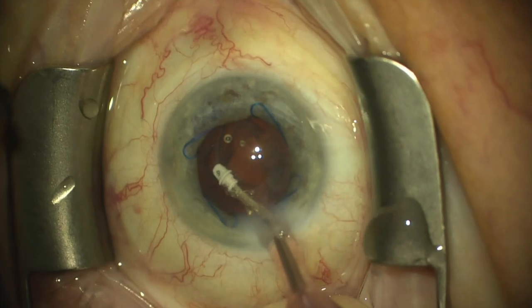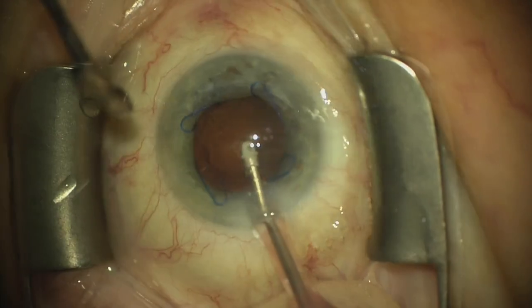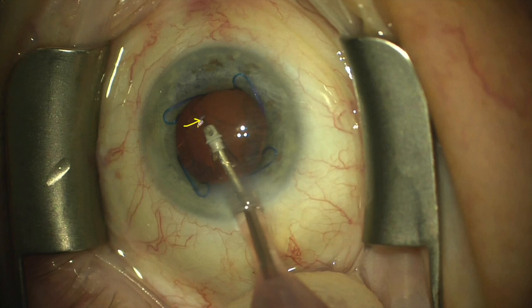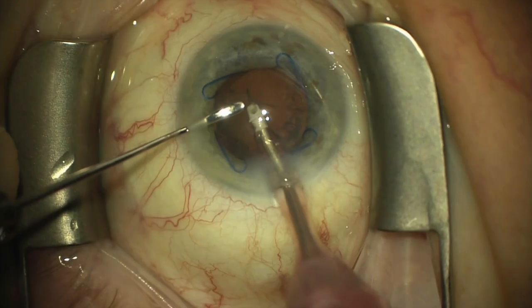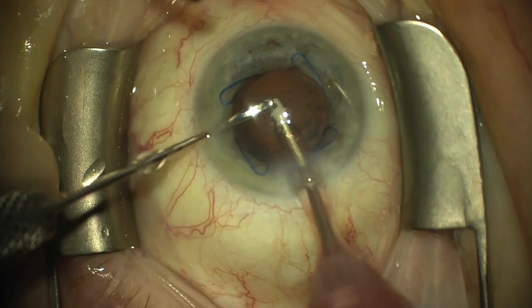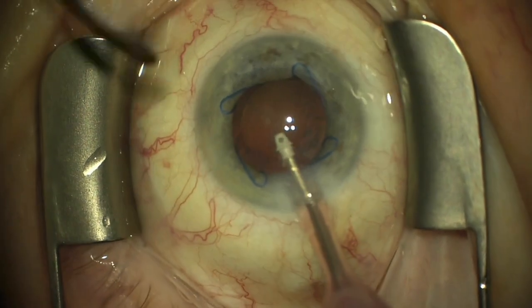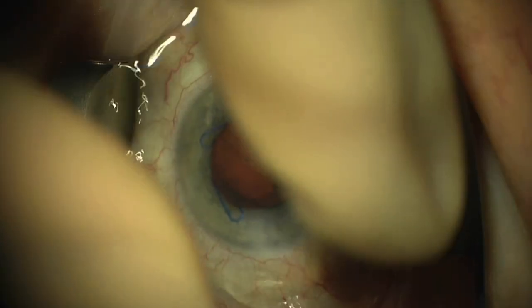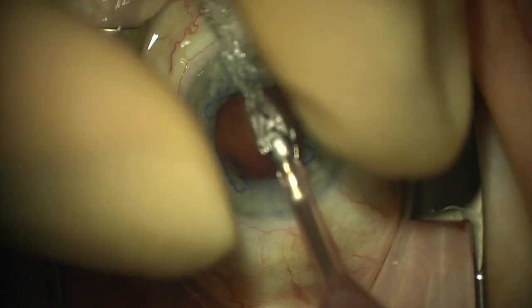Irrigation aspiration was then done to remove the cortical material, and towards the end of that process, you can see here some cortical material within the port of the IA handpiece and the anterior capsular remnant coming off the tip, with part of it actually going into the port as well. A Kahook spatula was then used to push in the small amount of cortex between the anterior capsular remnant and the port. The IA tip was then removed from the eye, and the anterior capsular material was grasped and removed.